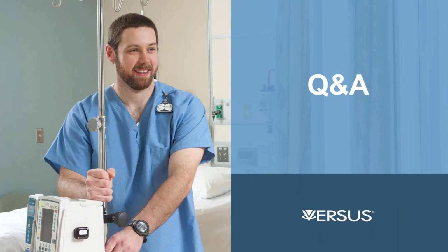So when you're in there, you can not only see that something needs a PM, but where it is. Or the other way, when you're assigning that locator tag, the equipment information can be sent over and integrated into the RTLS at assignment, so that the equipment number and the description are consistent and flow right into the RTLS system.